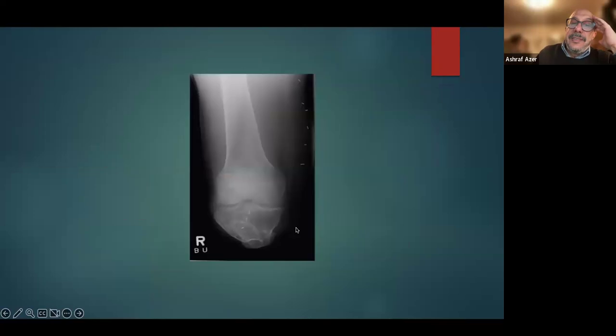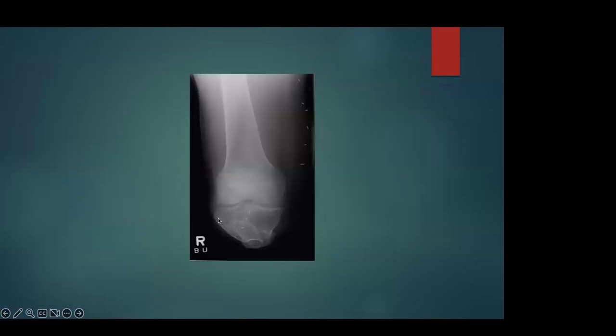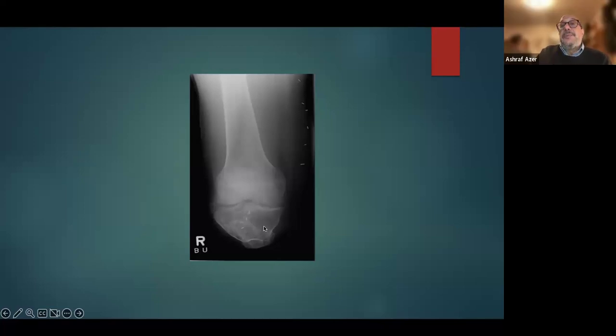Okay. طيب, what is that now? What do you think about this? Very short stump, very short bony level. So the amputation was there. Believe it or not, this is from the textbook, because the textbook will tell you the shortest we can get is to allow some flexion of the knee. Okay? But this is completely wrong.